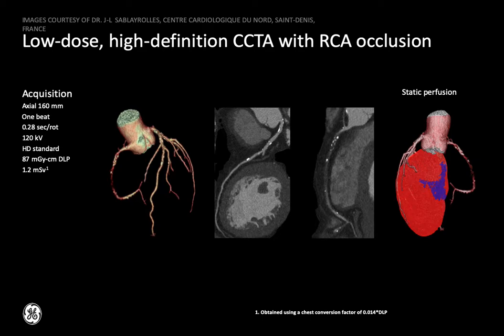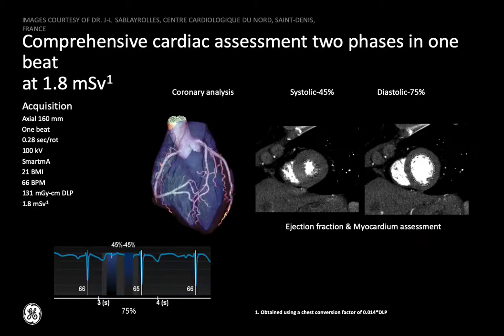All right. So if you wanted to measure cardiac function, the fewest number of frames you could acquire, given the fact that every time we pay a dose penalty, is 2 frames. When the heart's at its biggest and when it's at its smallest. You have 2 volumes, and you can ask, for example, here on the ECG, we took a picture in systole and then during diastole, or diastasis.